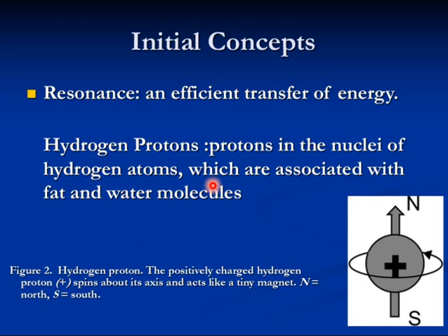Okay. So, in the MRI, we image the hydrogen. And we'll talk about why we use hydrogen. We image the hydrogen protons. Not electrons, protons. Hydrogen protons. So, where is the hydrogen in the body? Fat and water. Fat contains a lot of hydrogen. Water contains a lot of hydrogen. Okay? So, we image the hydrogen. We need to give the resonant frequency of the hydrogen. Okay?